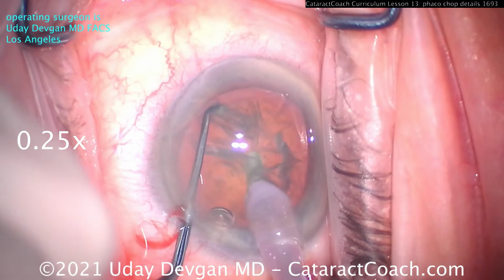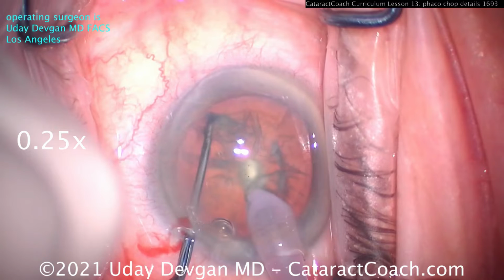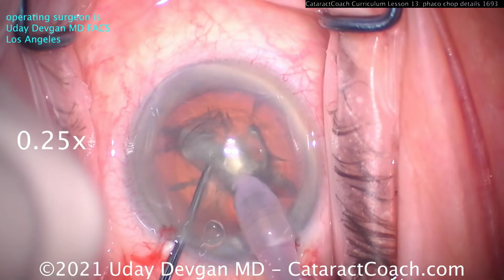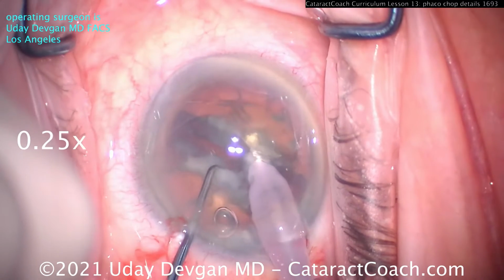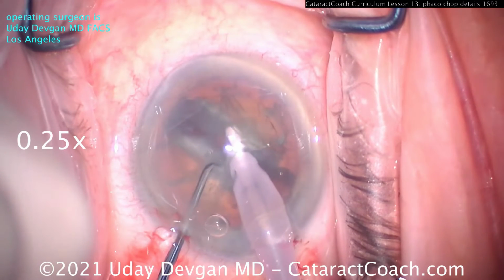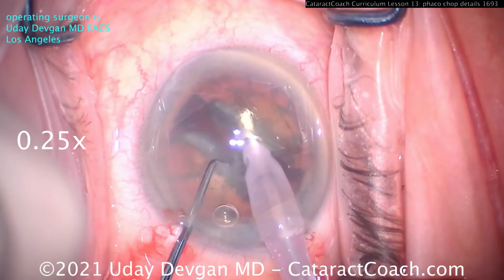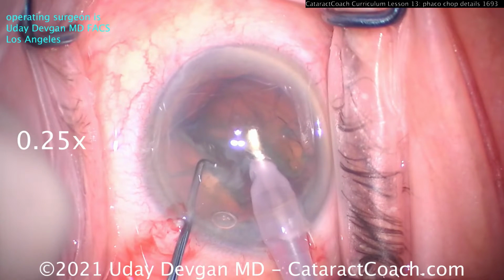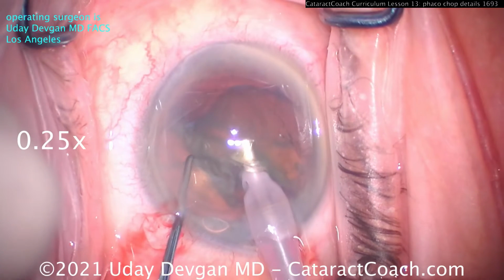Just push it towards the optic nerve. Now, two instruments are in the nucleus, bring them together and apart. And here you can see there's the crack, and you can propagate it all the way through. Now the left hand, the chopper is going to hold one nuclear half out of the way to create a little bit more room. And we can bring the first nuclear half out of the capsular bag.